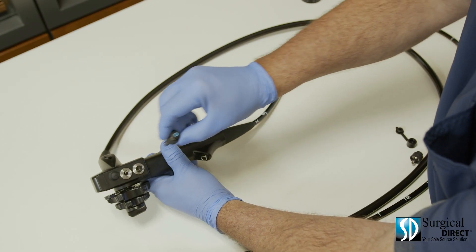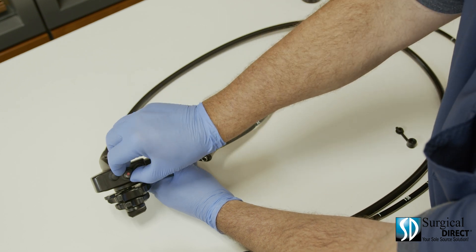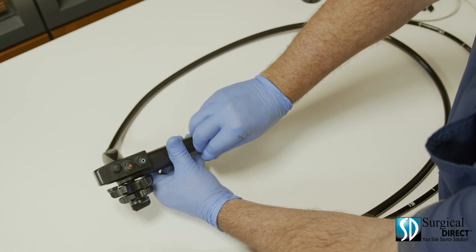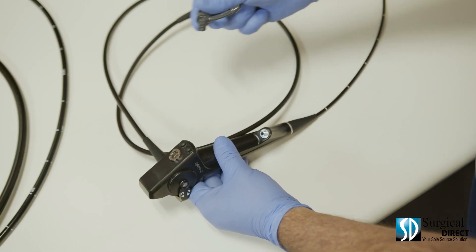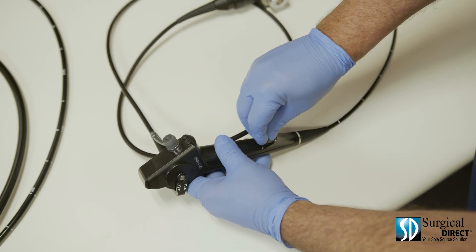To prepare the scope for use, insert the blue air water valve, suction valve, and attach the biopsy port cap. This is the veterinary bronchoscope. To prepare it for use, insert the suction cap and the biopsy port cap.